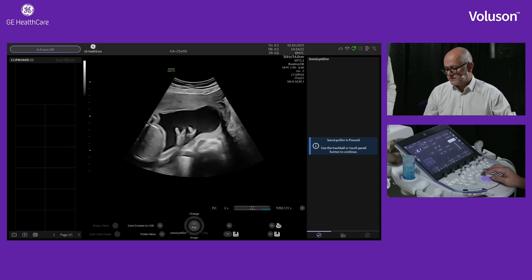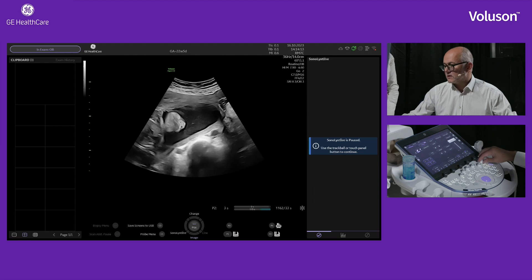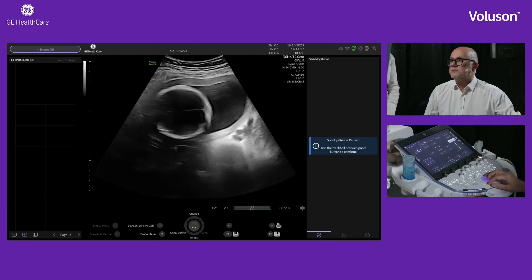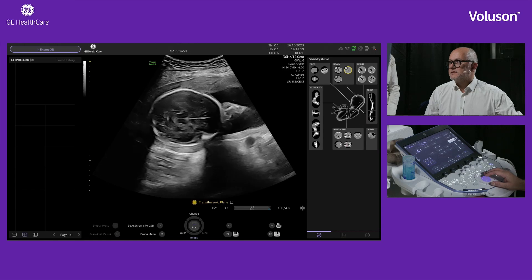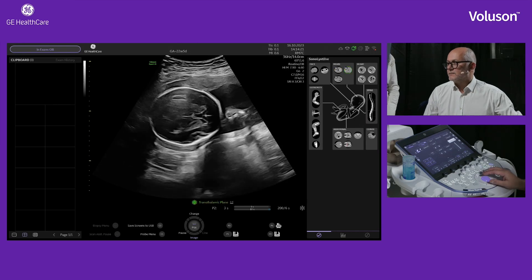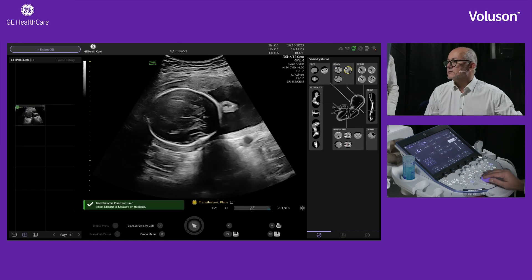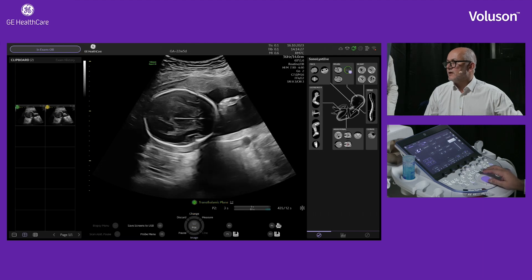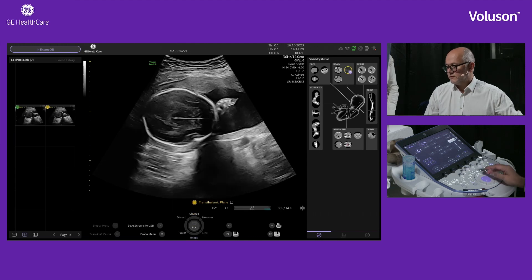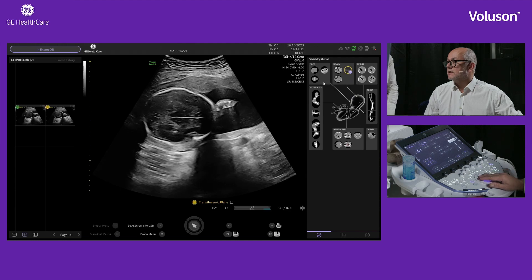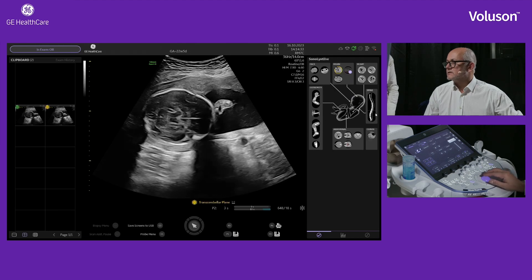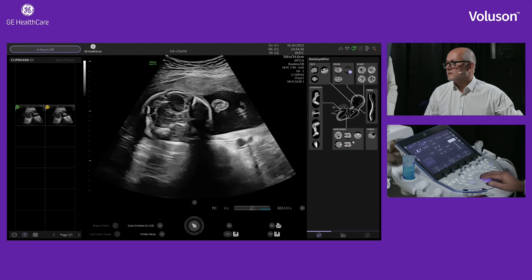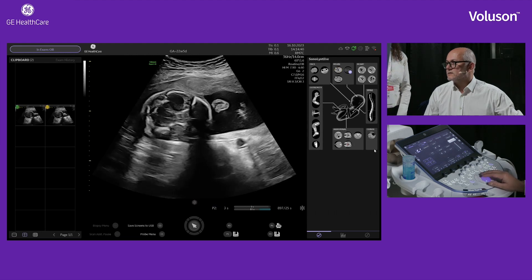So what Sonalus Live is going to do is capture images in real time. The first thing you'll notice is a cartoon baby on the right-hand side, and all around it are all the views we need to capture during our anomaly scan: the spine, the heart views, the brain views, facial views, extremities, abdominal views, and uterine cervix.